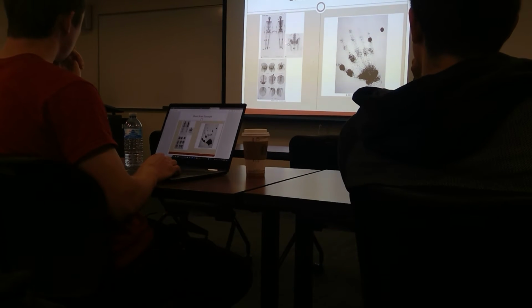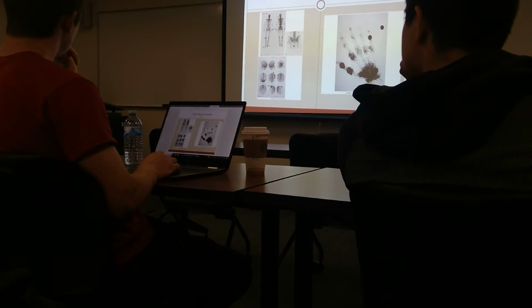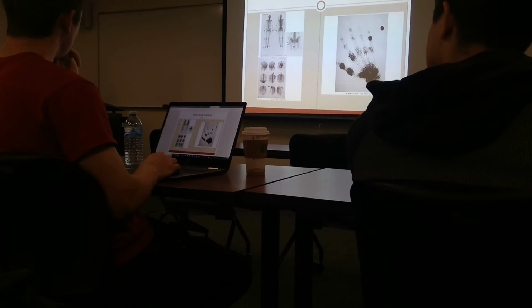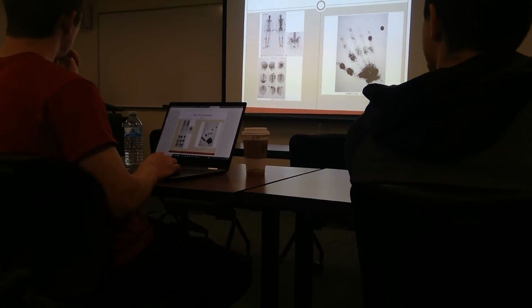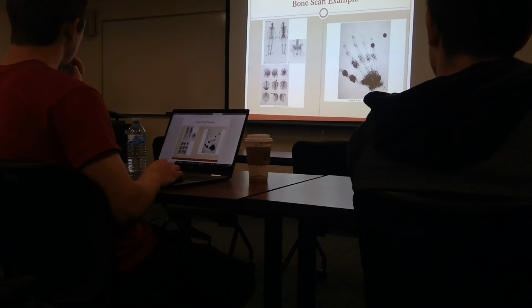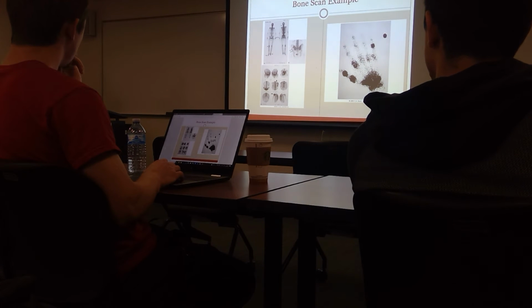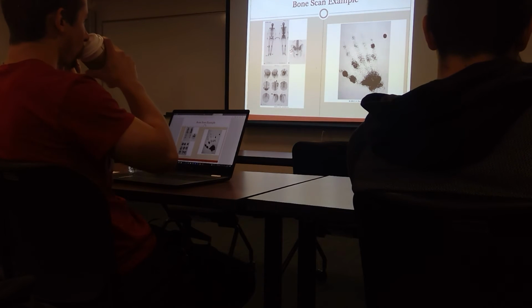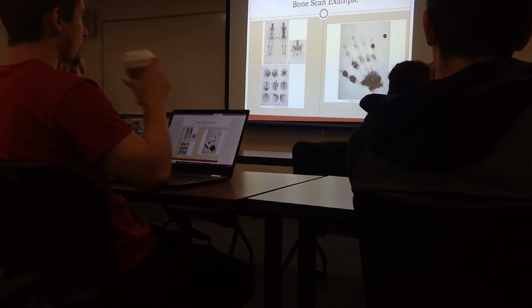It showed up as just an increased uptake in the gluteus medius, and then they had to do more testing. And usually what you find out is if you do a radiograph, within the muscle you'll see the bone, and you won't see the muscle, but you see a thin line, like a thread of bright white tissue, sometimes as small as a thread within the muscle, and that's what myositis ossificans looks like. But it's an ongoing inflammatory thing, so they first detected it with the bone scan.